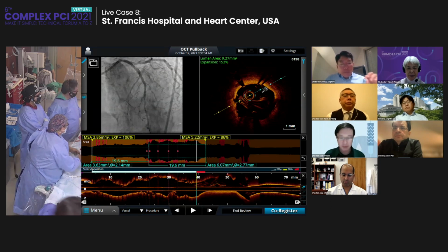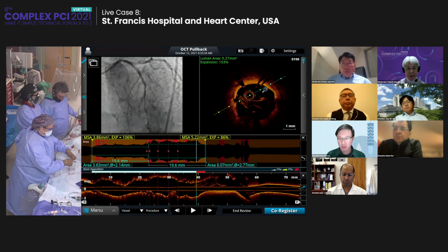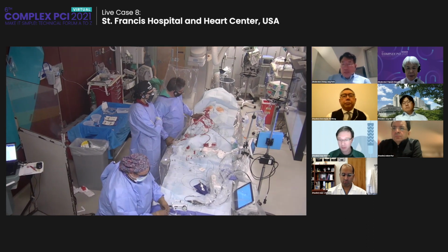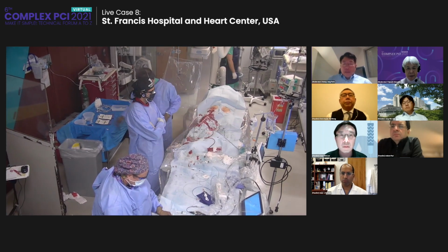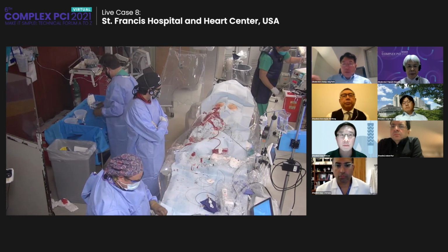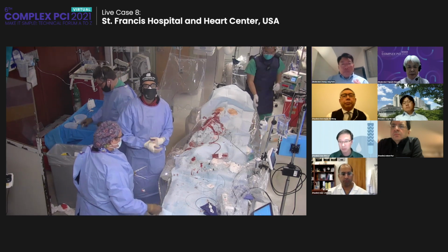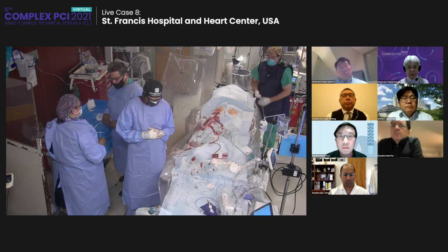All right, so I have a simple question. In some cases, we didn't do the pre-plaque modification with a non-compliant balloon, shockwave, or something like that. After the stent, a very focal portion would be an unexpanded stent by outside calcium. For those particular cases, can shockwave still work?